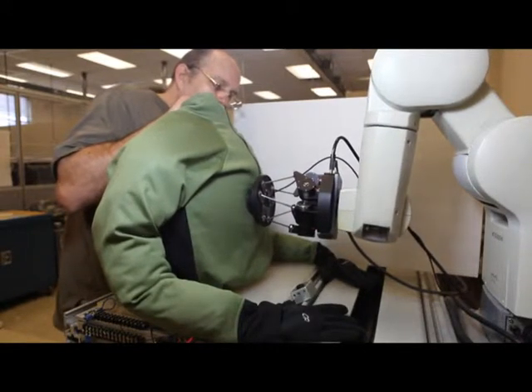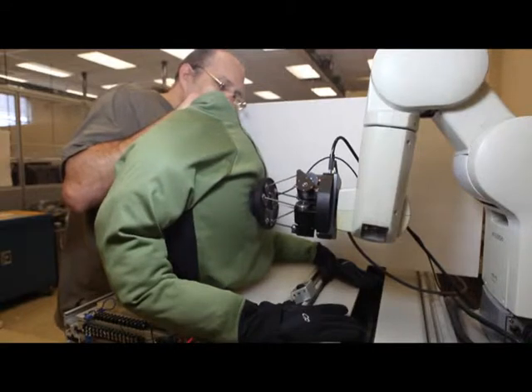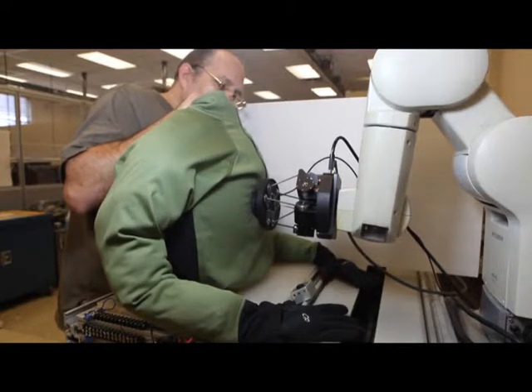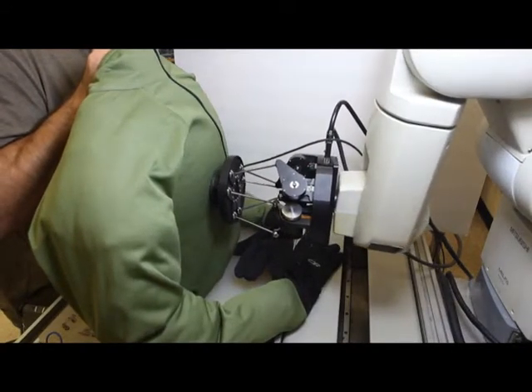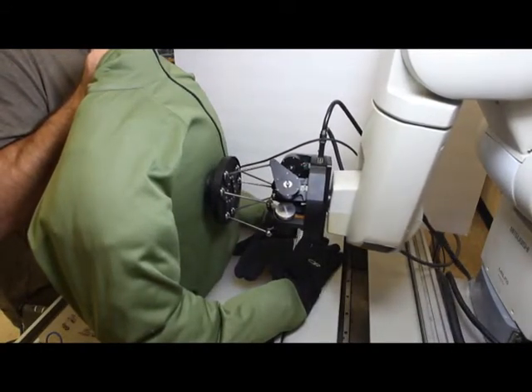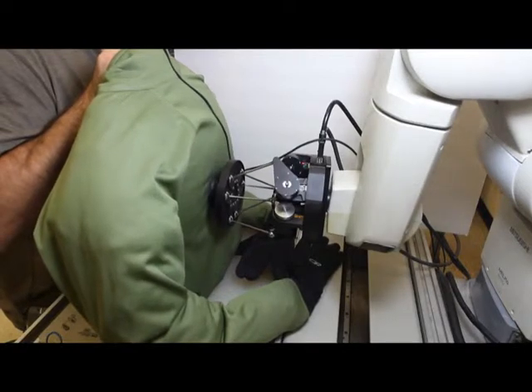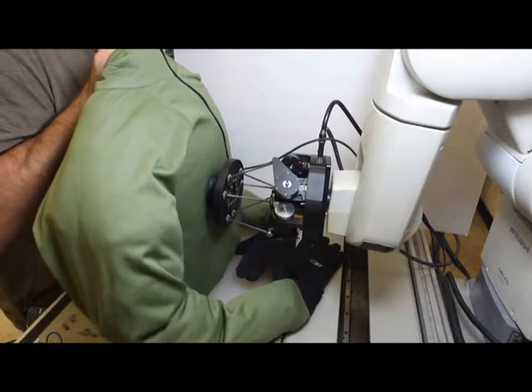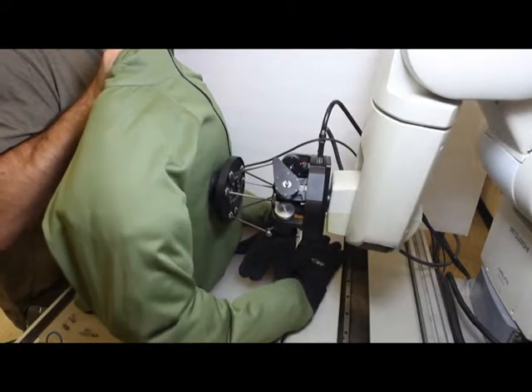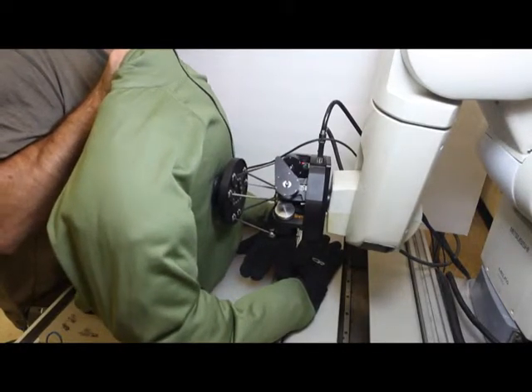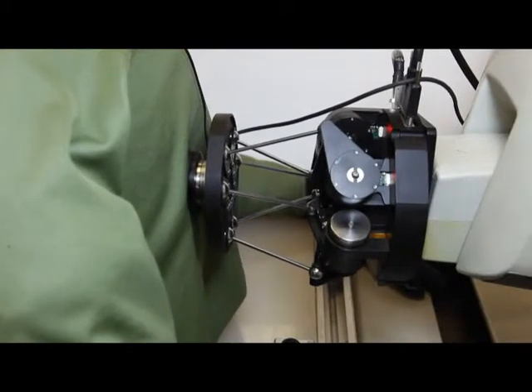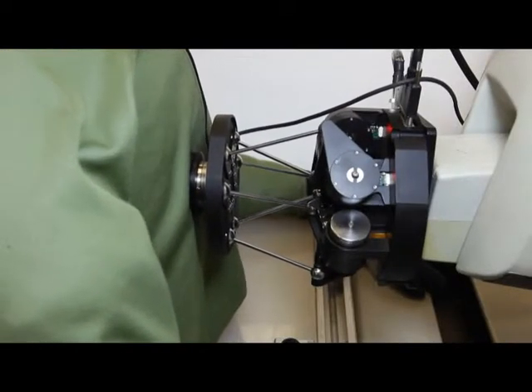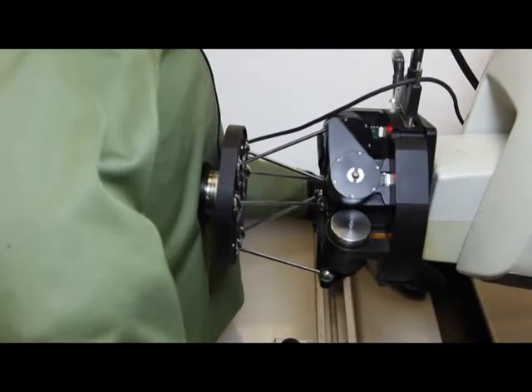The Army topic authors envisioned a future battlefield medical system able to assist a medic by holding an ultrasound or other device with steady pressure against a soldier during emergency evacuation, thus freeing the medic for other simultaneous medical procedures.